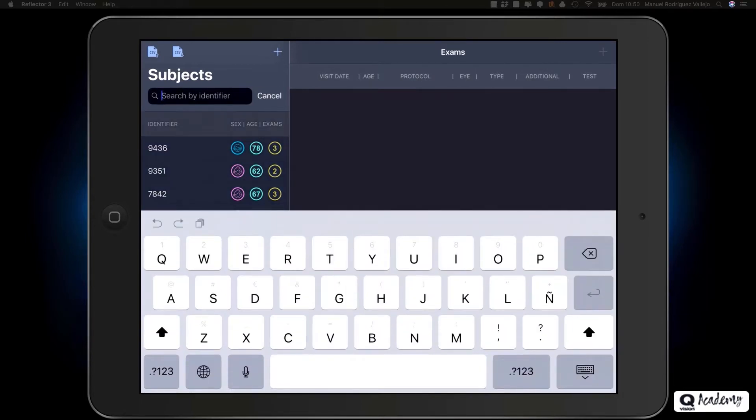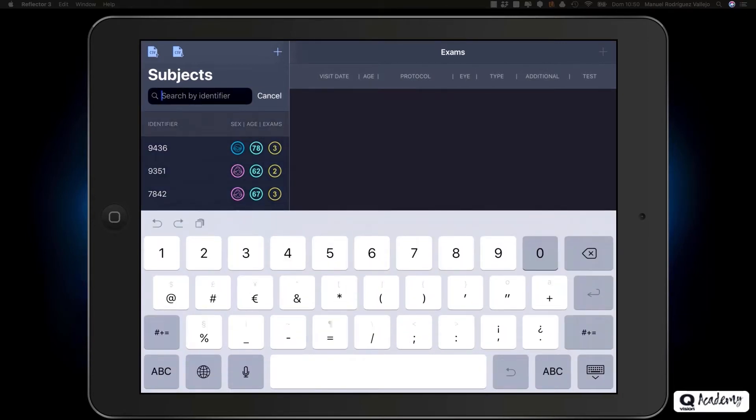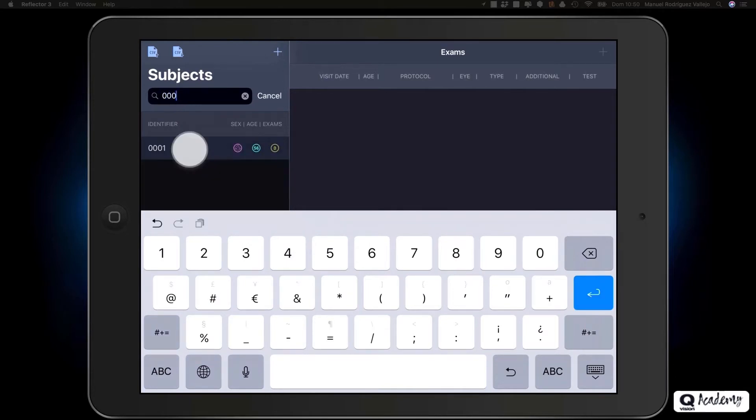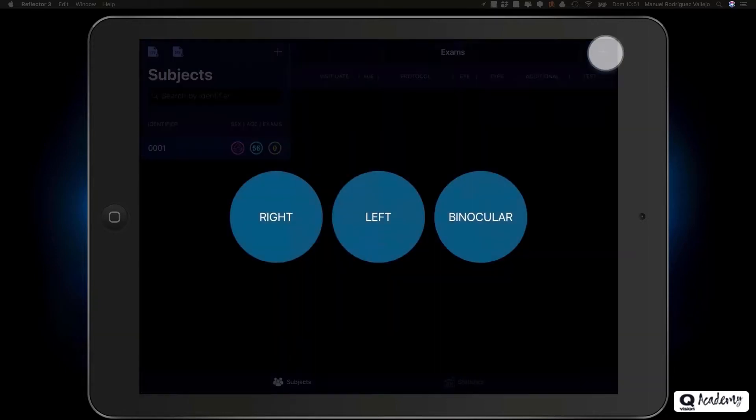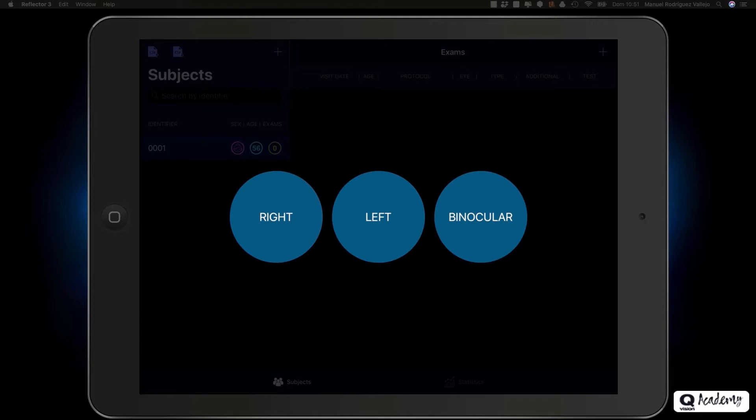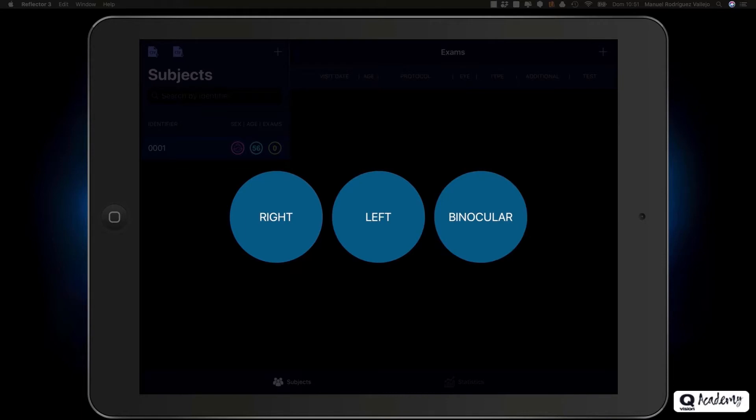Subjects can be assigned multiple exams. To assign a new exam to a subject, select the subject and click on the plus button at the top right in the exam table. A pop-up window will appear, where you will have to select whether the examination is to be performed monocularly on the right or left eye, or if it is to be performed binocularly. We will start with the right eye.